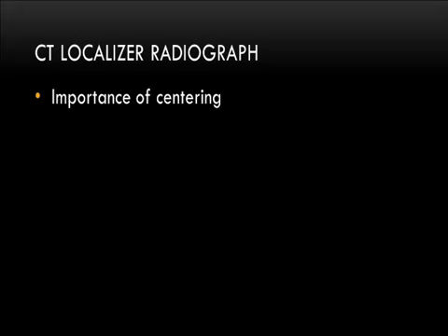I put a placeholder here to say centering is important when you do the CT radiograph. Mark is going to go through that in a little more detail to show you some of the implications if the patient is not centered, either too high in the gantry or too low, that has some implications that are going to trickle down to the automatic exposure control system. So this is just a reminder to pay special attention when Mark talks about that.